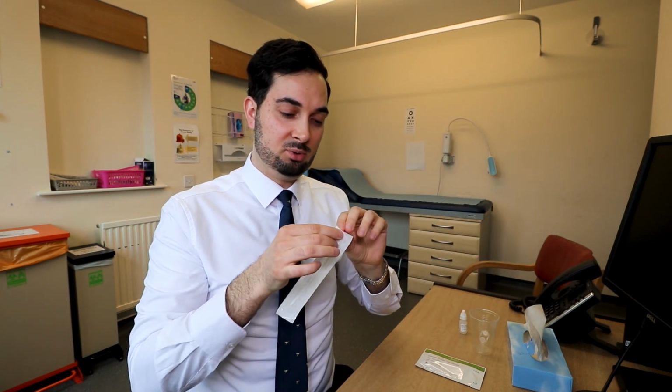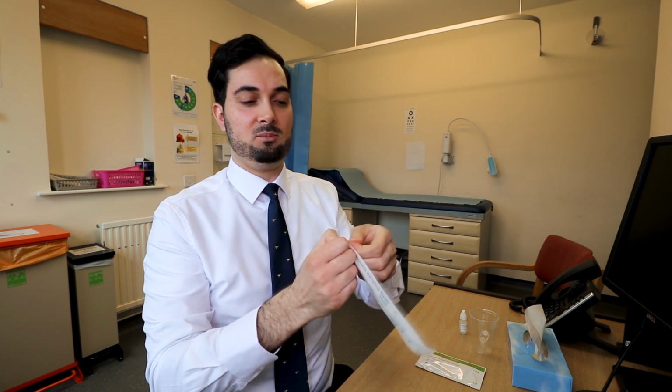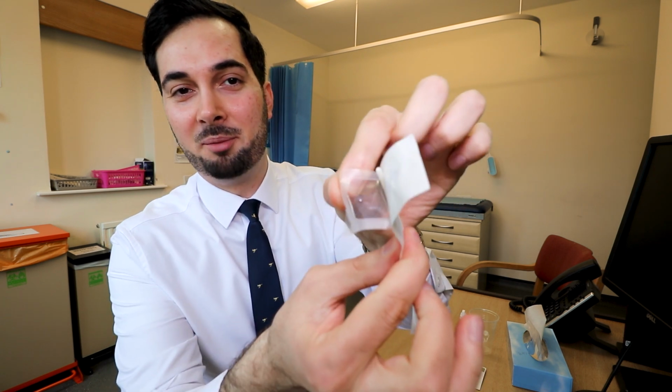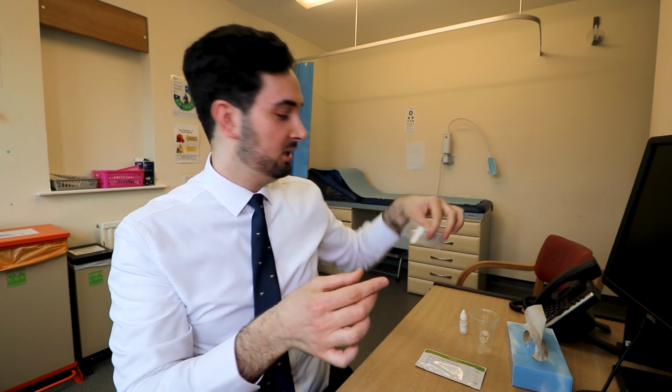So give that a quick open, if I can open it, that is. So just open that up so it's ready. I never open it fully, I only open it about that much, just so it doesn't get dirty and contaminated. I'm just going to place it here for now, just so it's ready.